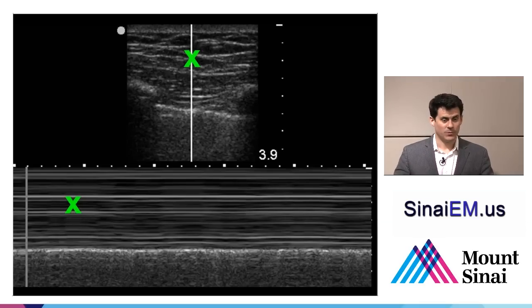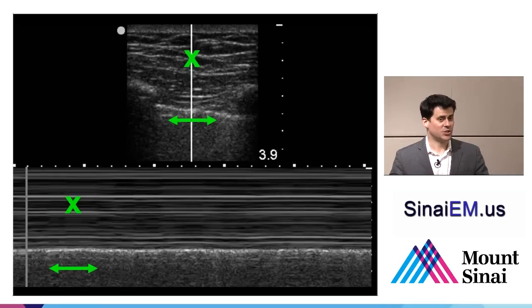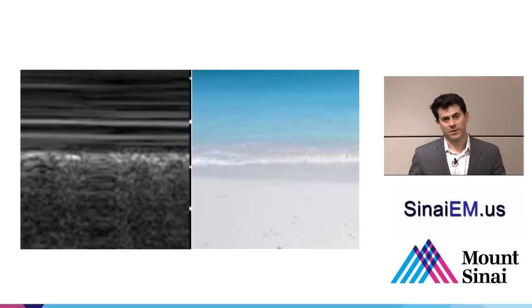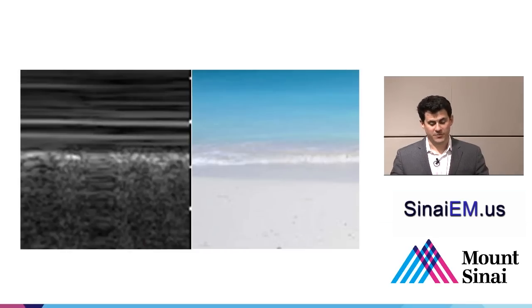Beneath the pleura, we see graininess, which represents side-to-side motion on M mode. So above the pleura, flat lines means you're holding the probe steady and the patient's chest wall isn't moving very much. Below the pleura, grainy lines mean the lung is sliding back and forth, meaning no pneumothorax. This sign of flat lines on the top and grainy lines on the bottom has been referred to as waves on the beach, where we would see the smooth waters on the top and the grainy sand below, and this sign is reassuring that the patient has no pneumothorax at that location.